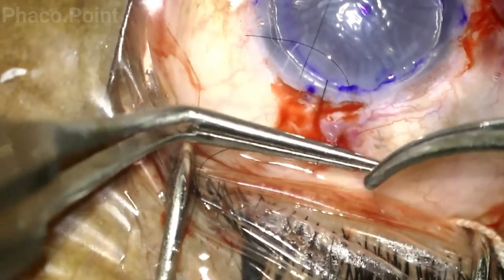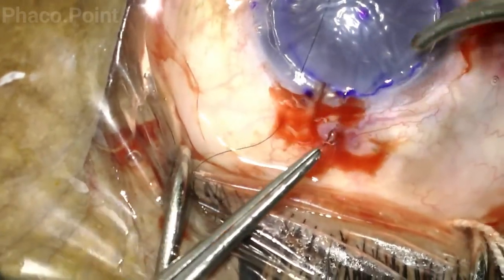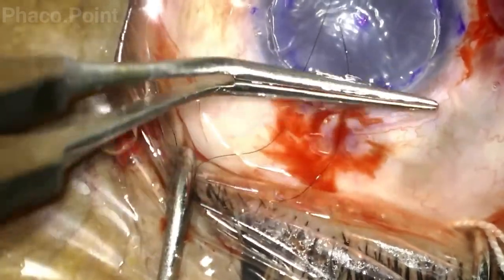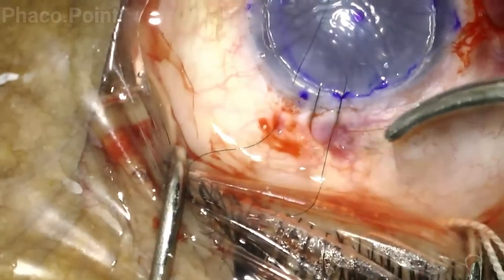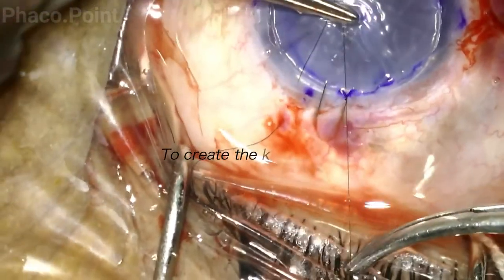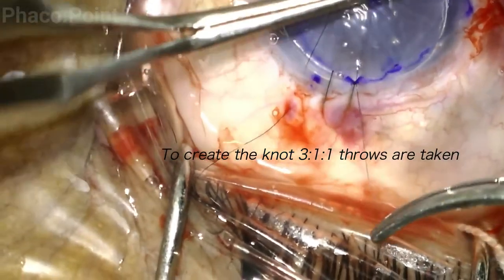To tie the knot, one free end of the suture is held with the plain forceps and a McPherson's forceps is used to create a knot with a three-throw on the first pass. Achieve the optimal level of tautness, then a second throw from the opposite side as a single throw, tightened, then one more. This completes the suture.